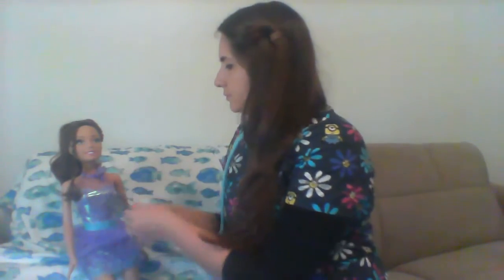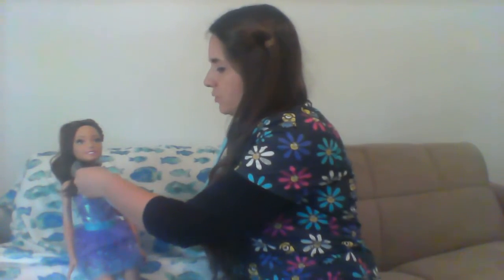So the bell of our stethoscope is the smaller side, the front is the diaphragm. So we're going to use the bell and we're just going to take a listen and make sure that there are no bruits. And again, do one at a time, don't do them at the same time.